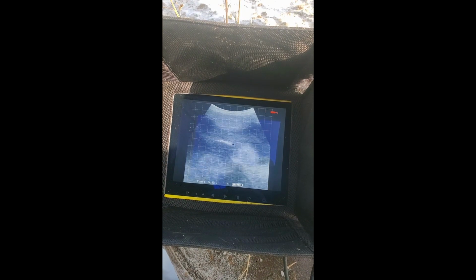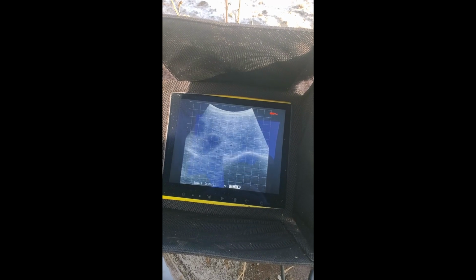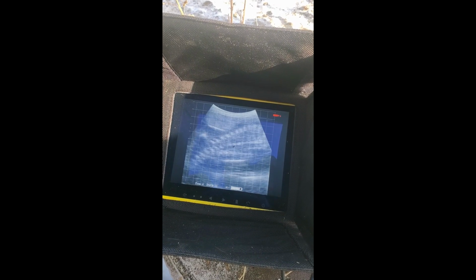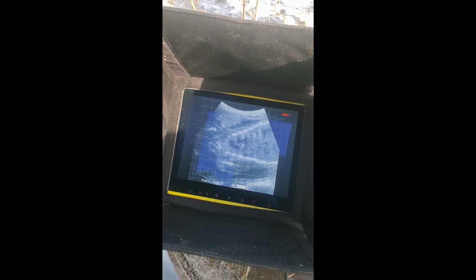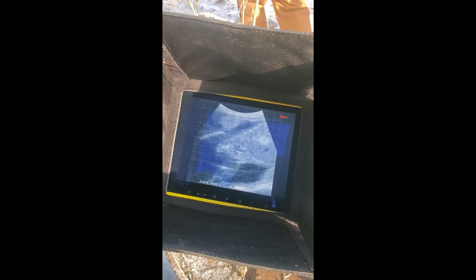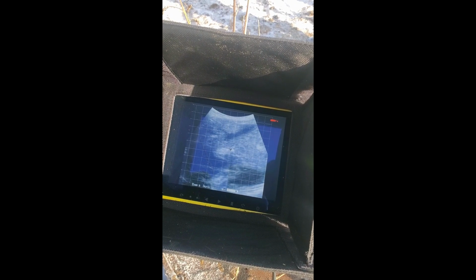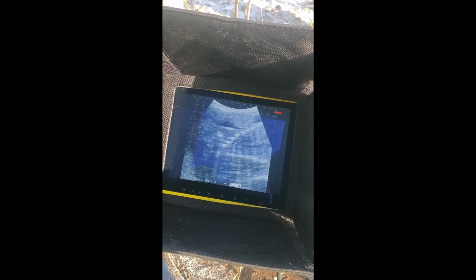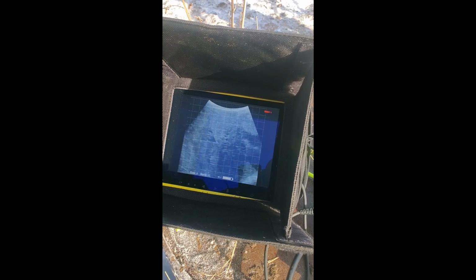Spinal cord. He's swimming around in there. He's bashful. There he is. There's a heartbeat. Look at that. That's good. And it's a he, you said. There, you can see front legs coming off there. Yes, you can. We aren't deep enough to get to the head, but nice and healthy when they're moving.